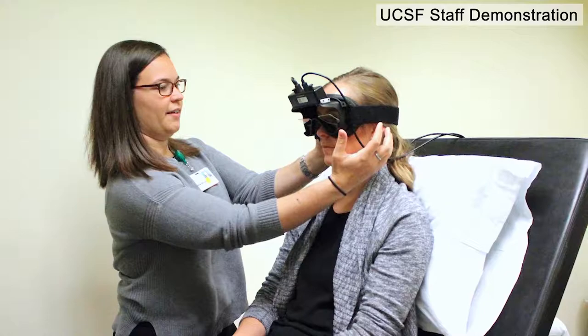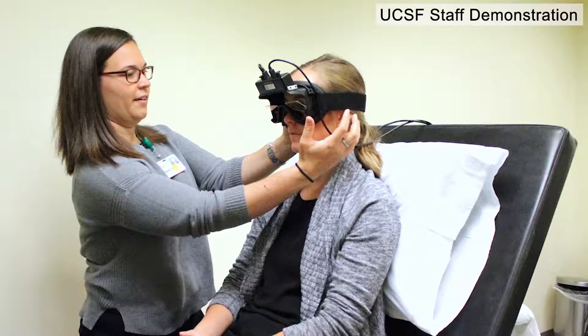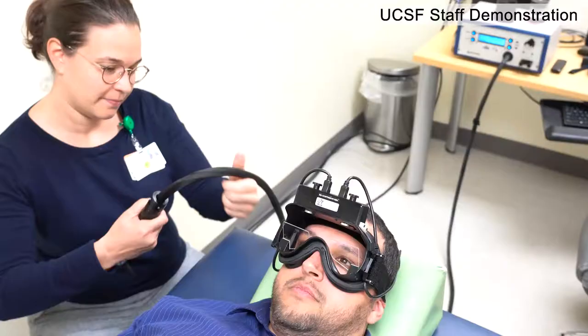Next, you'll be asked to move your head and body through several positions and maneuvers, such as shaking your head side to side, while the goggles watch for nystagmus patterns that provide information about whether a higher vestibular system is being activated.